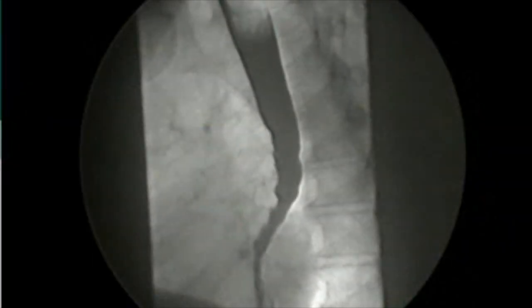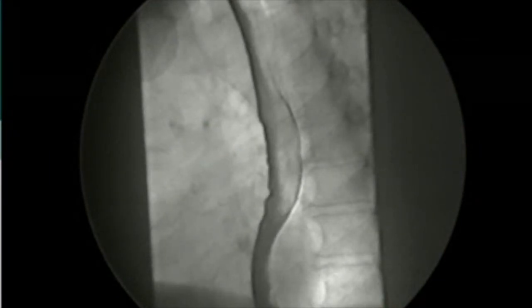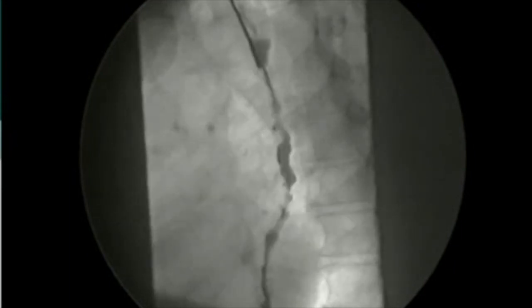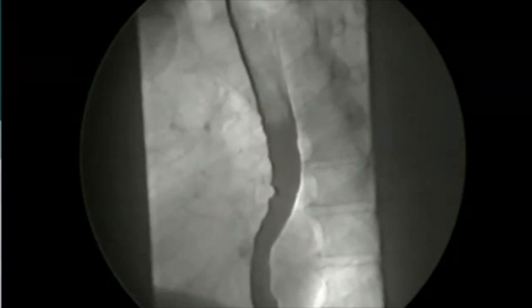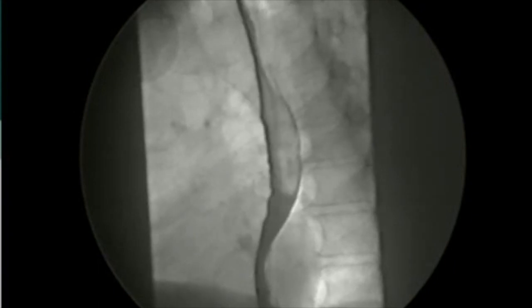Here you see a short loop of a movie of a patient whose esophagus is giving trouble. The image shows a view into the patient from the side. The patient is actually swallowing barium contrast. The black column in this image is barium passing through the esophagus as the camera is filming it.